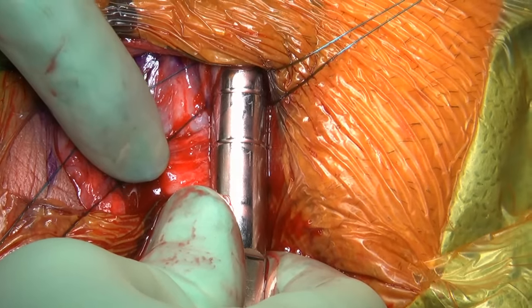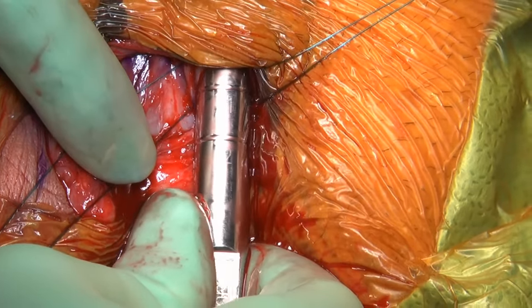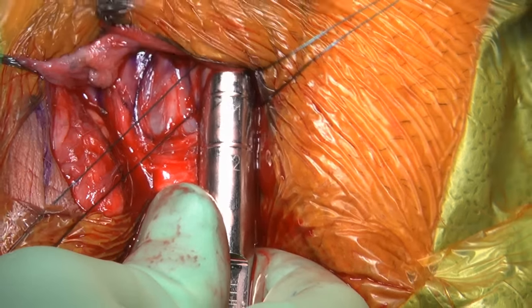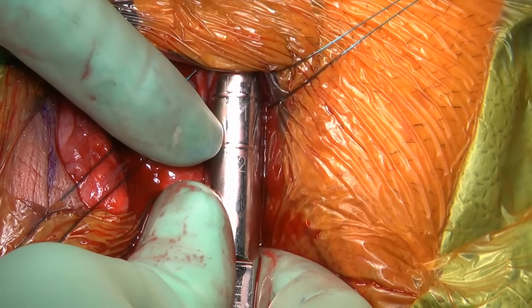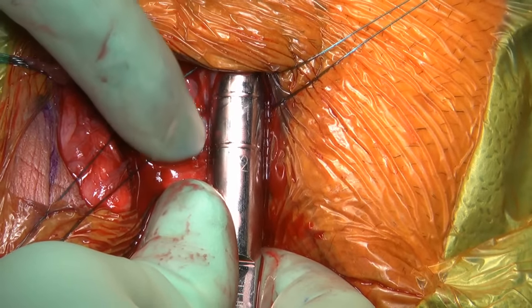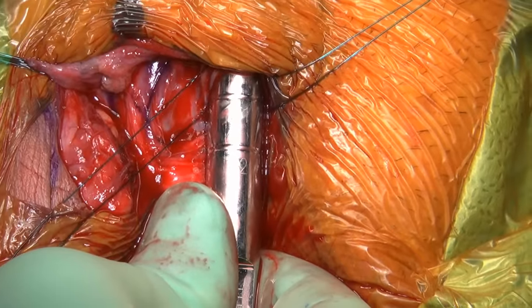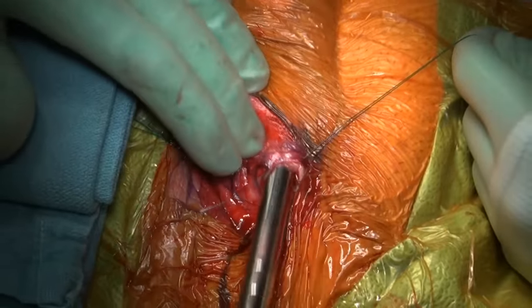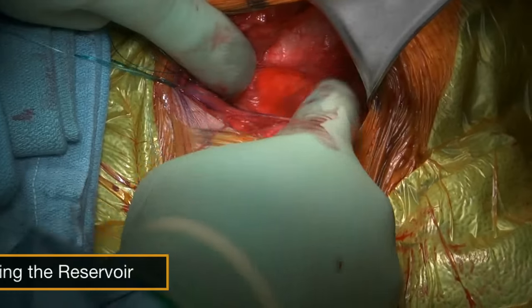For these measurements, I will select an 18 cm prosthesis, the AMS 700 LGX, with 3 cm rear tip extenders. There are multiple ways to accurately measure the corpora. I recommend that every surgeon have their own way that they use every time for accuracy and reproducibility. To implant the fluid reservoir, we want to create a pocket in the pre-vesicle space.